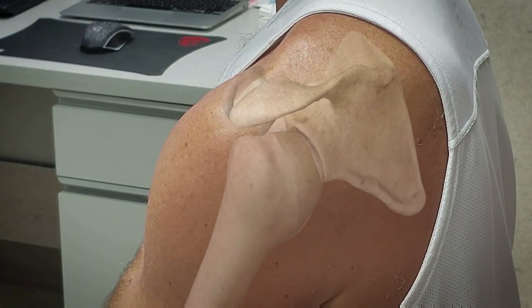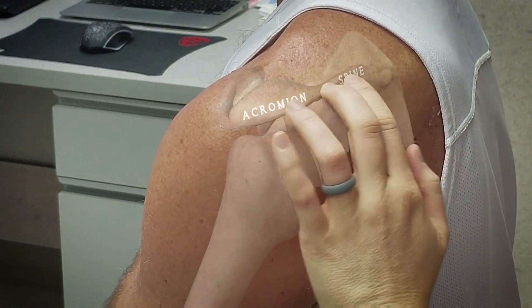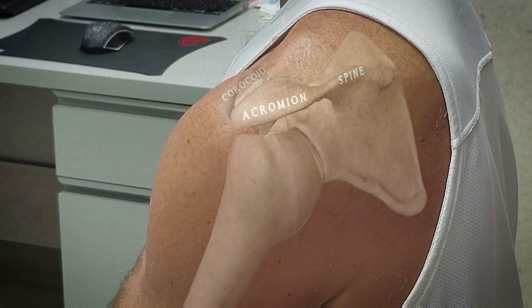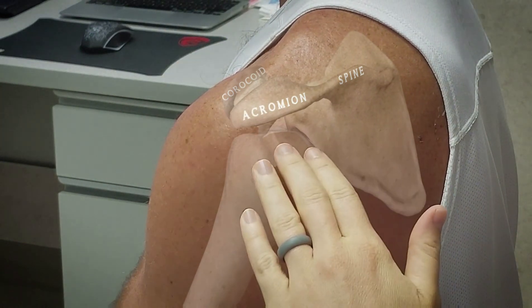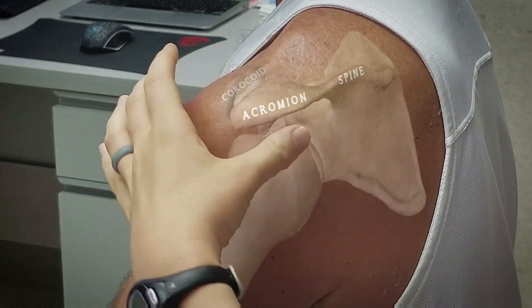Three bony landmarks might be helpful for this procedure: the acromion, the spine of the scapula, and the coracoid process anteriorly. The probe should be placed in the transverse plane just inferior to the acromion and parallel to the spine of the scapula.